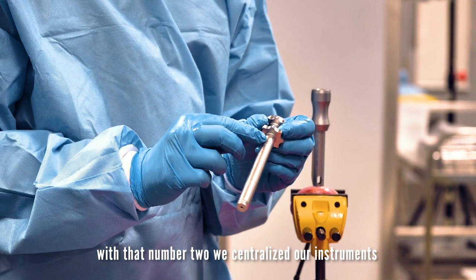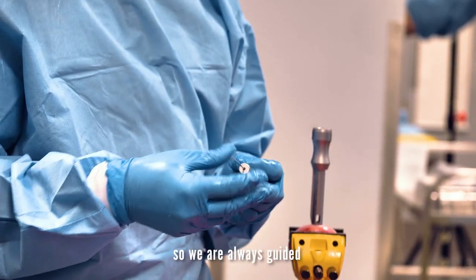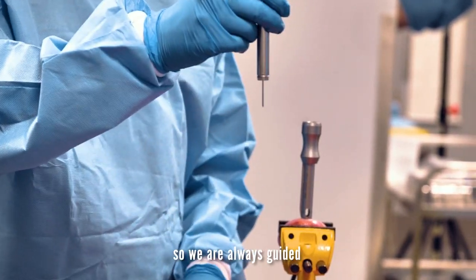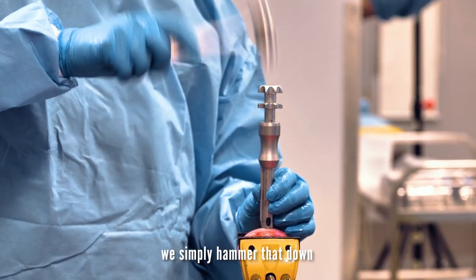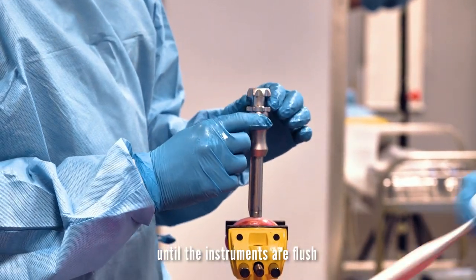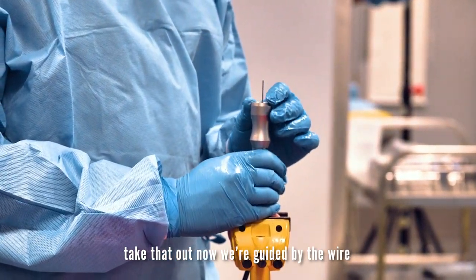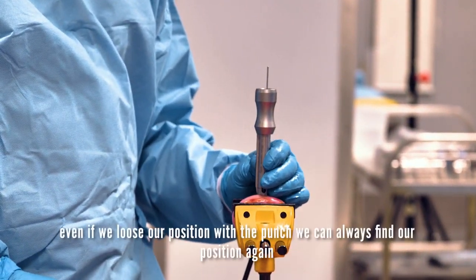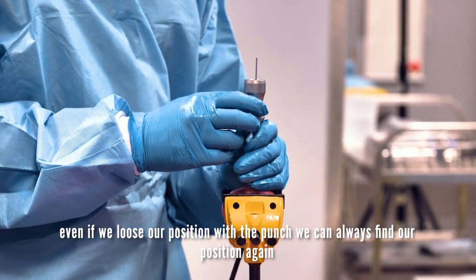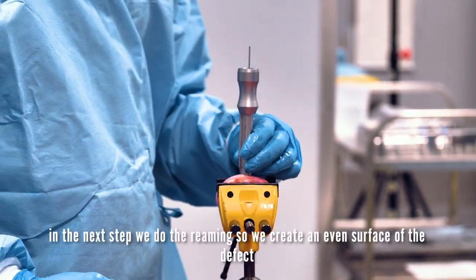With that, number two: we centralize our instruments so we are always guided. We simply hammer that down until the instruments are flush and take that out. Now we are guided by the guideway, so even if we would lose our position with the punch, we could always find our position again.